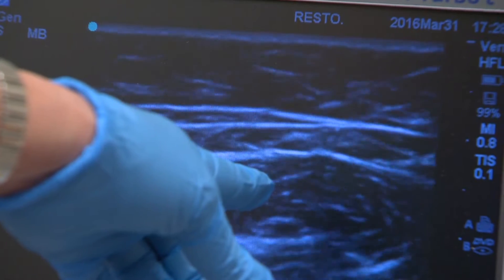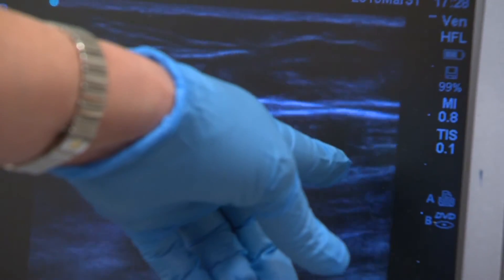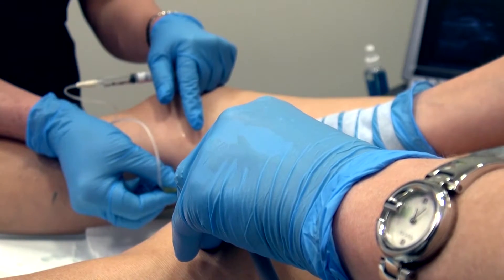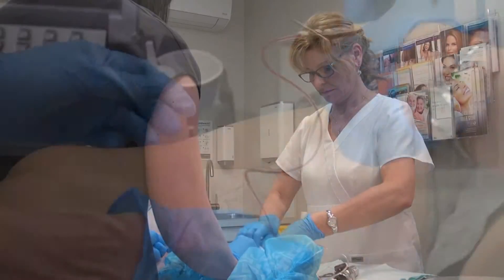Where the medication did not reach, we can see that the vein remains very dilated. We then withdraw the needle and access a lower point in the leg where the medication did not reach. We will generally do at least two or three injections to treat this large vein, moving down the leg.